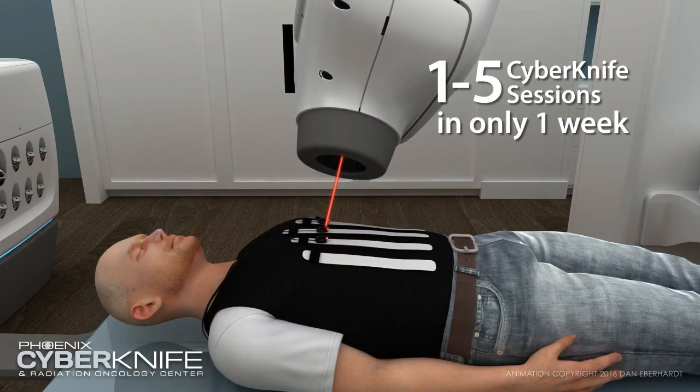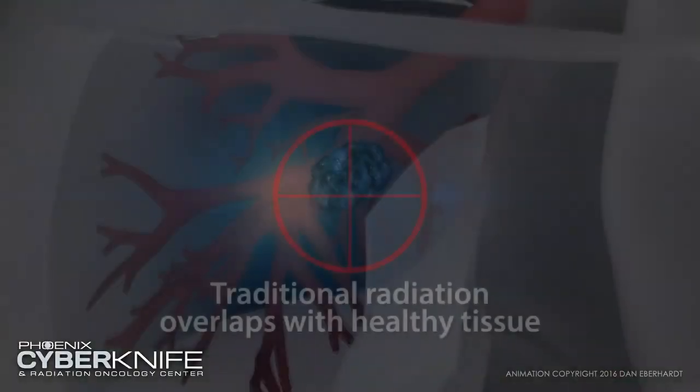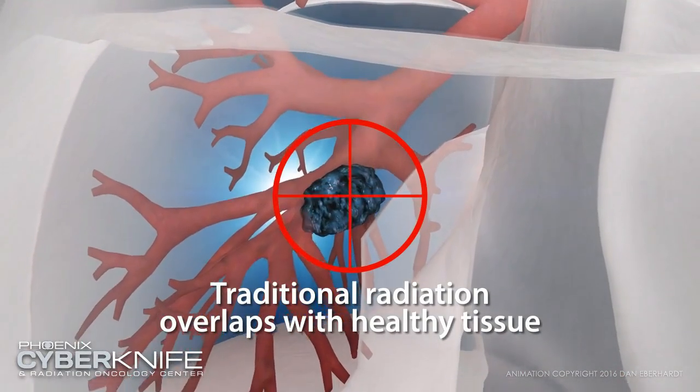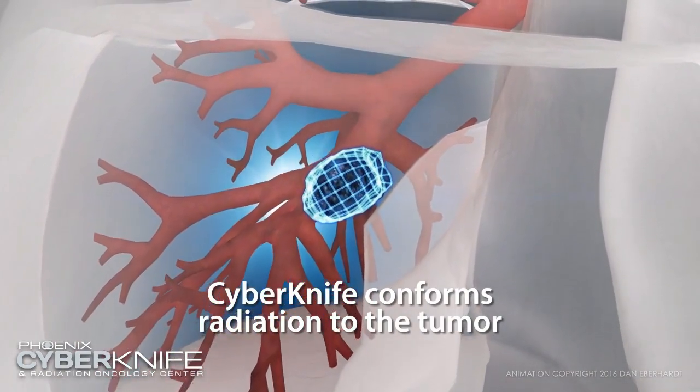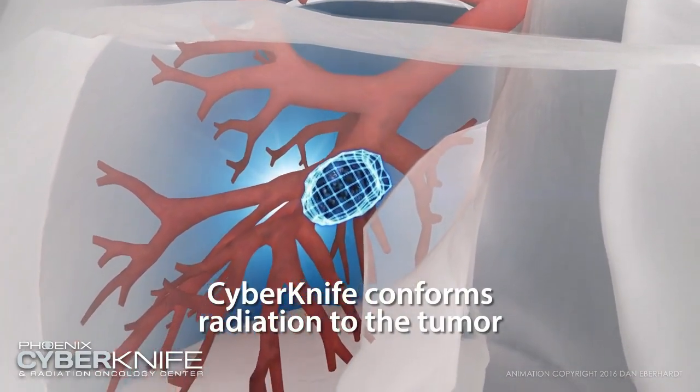This robotic delivery and real-time image guidance have set the standard for delivery precision and enables stereotactic radiosurgery, or SRS, and stereotactic body radiation therapy, or SBRT treatments for the full range of tumor types.